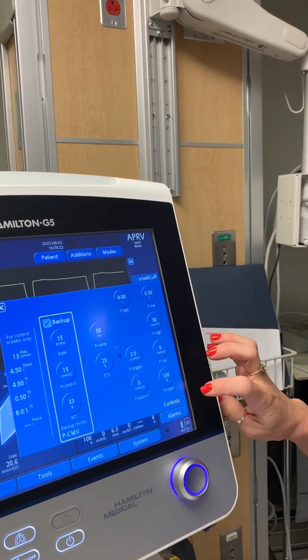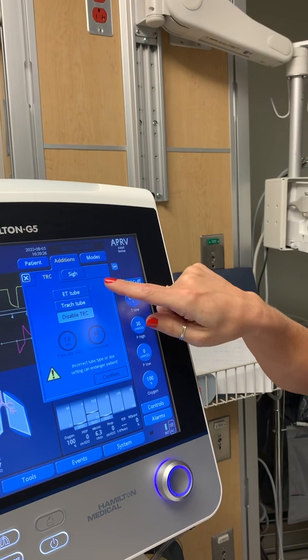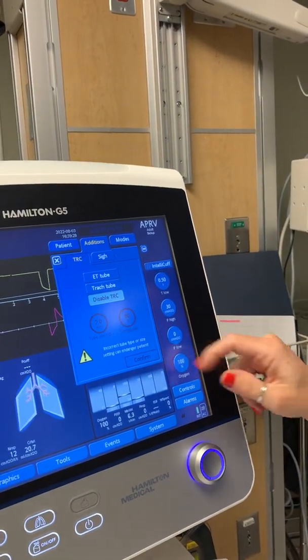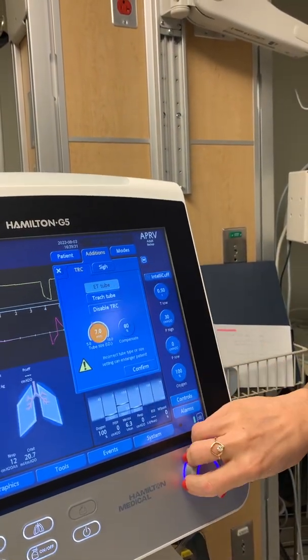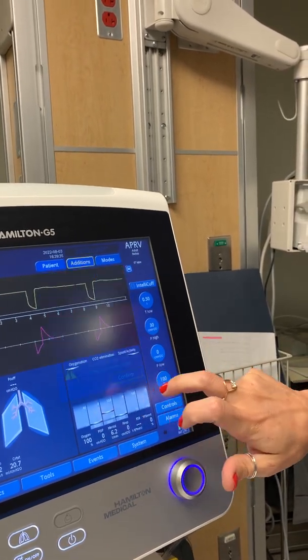Start oxygen at 100%. Also set up your TRC — tube resistance compensation — with an 8 tube at 100% in order to support spontaneous breaths.